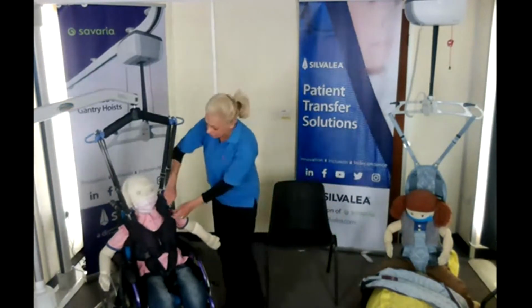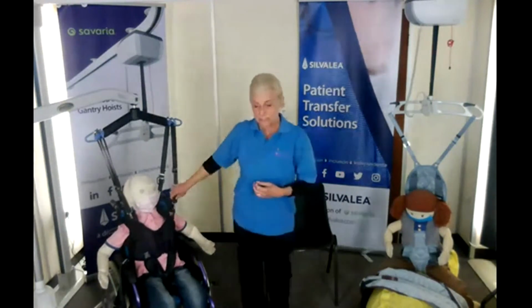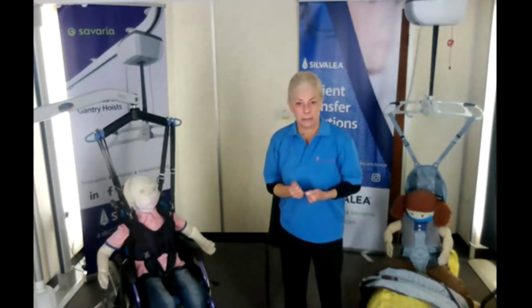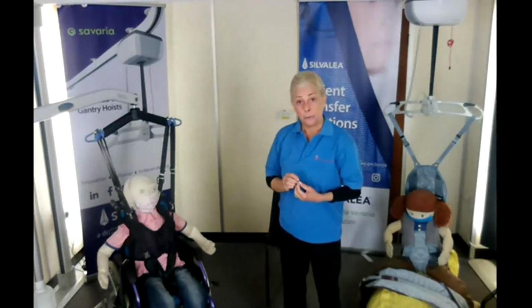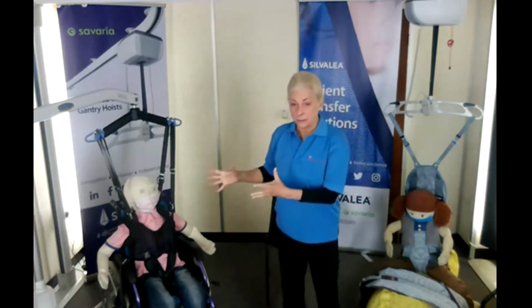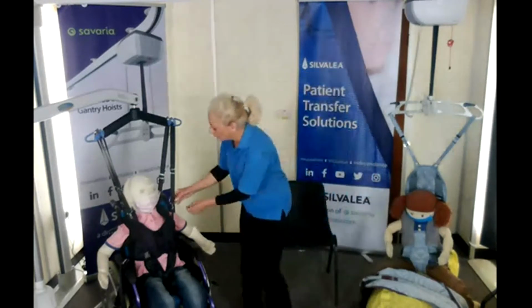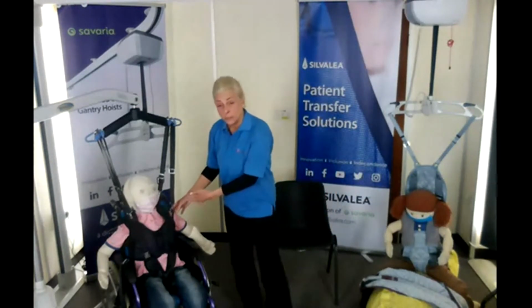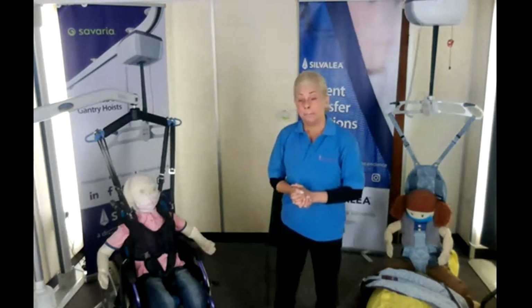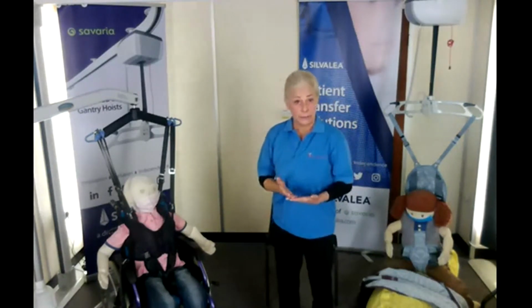The tapes do detach. So initially it was developed and designed for an able-bodied toddler whose mum had limited strength to lift. So dad would put the harness on, and then when mum needed to lift the youngster into his buggy or high chair, she was able to clip on tapes, and then the hoist would just gently lift him into the high chair or the buggy. So it worked really well. So then we introduced it as an option for other things.